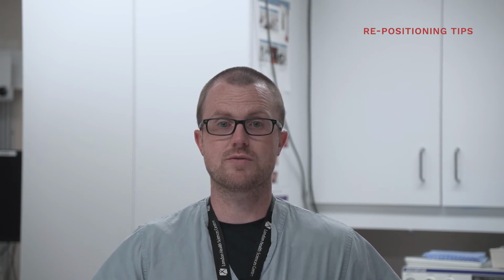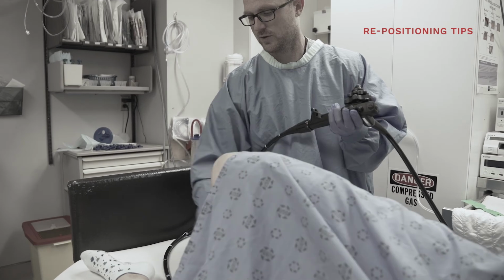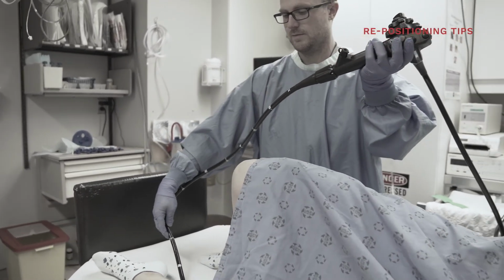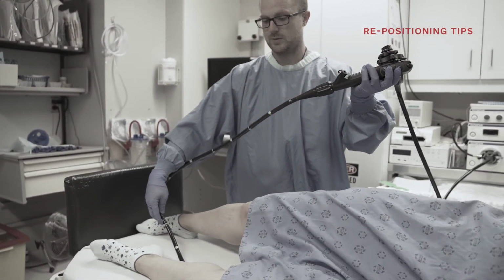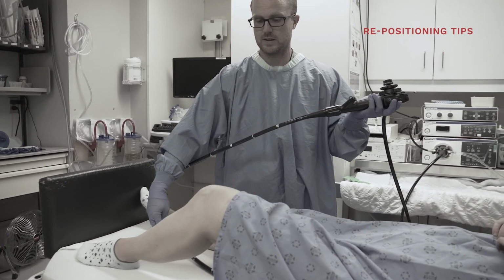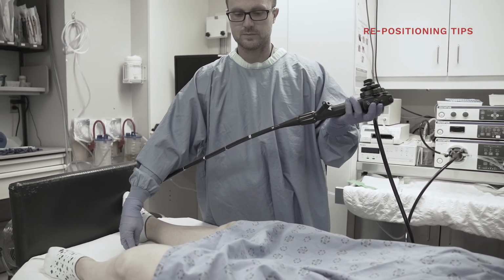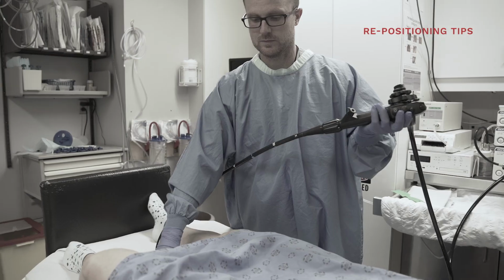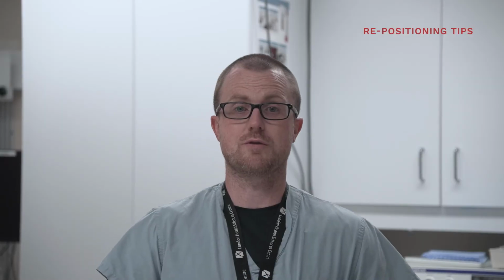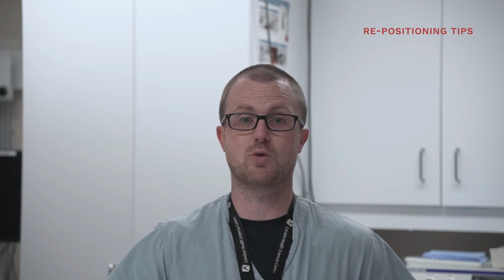The external portion of the scope is extended straight towards the foot of the bed. The patient is instructed to lift the right leg so the scope can be passed between. The patient then rolls onto their back with the right leg straight and the left leg slightly frog-legged. The straight right leg keeps it out of the way of the endoscopist, and the open left leg allows access to advance the scope. Rotating further to right lateral decubitus follows a similar approach to that shown before.